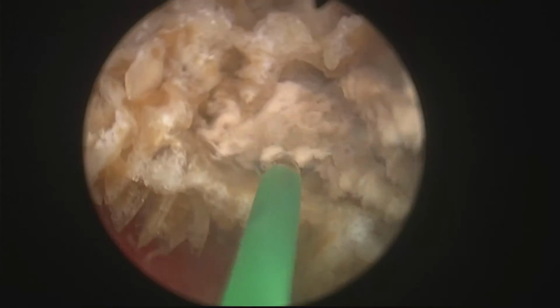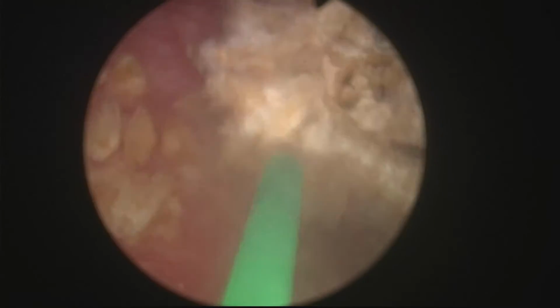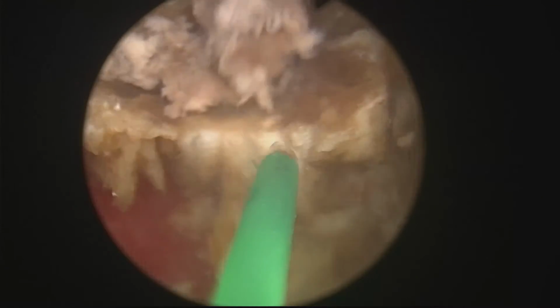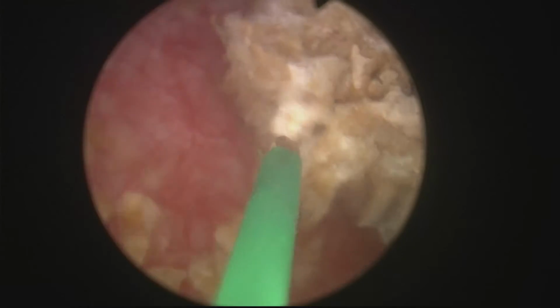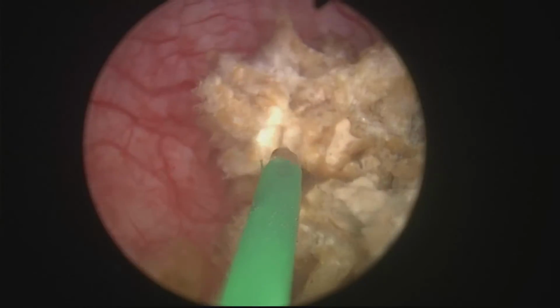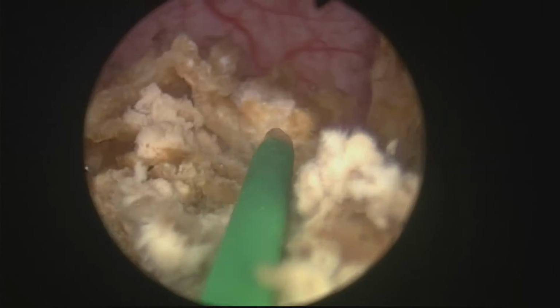I guess it is imperative when you do endoscopic surgery, especially TURP, to check inside the diverticulums to see if there's any tissue left behind, because this could be the consequence of forgetting a piece of tissue inside this diverticulum.